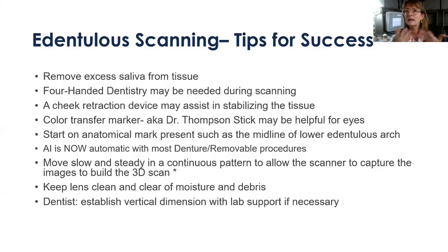So when I'm scanning, let's say a maxillary fully edentulous palate, and I want it to stitch together, if I put some markings, some little X's or a back and forth, almost like a Christmas tree down the palate, it provides something for my eyes to follow.